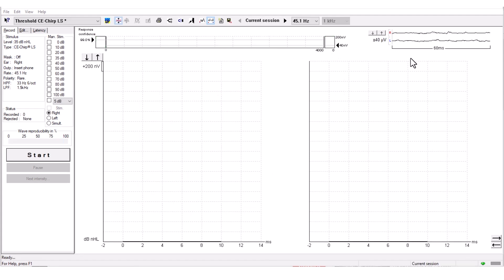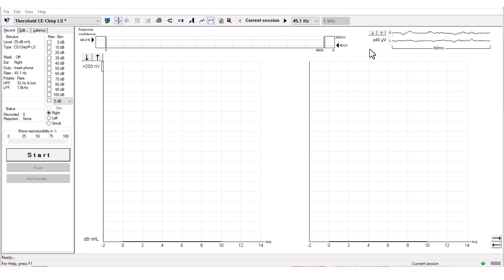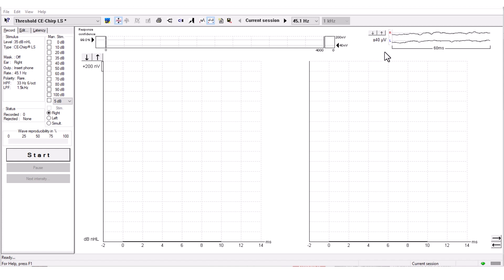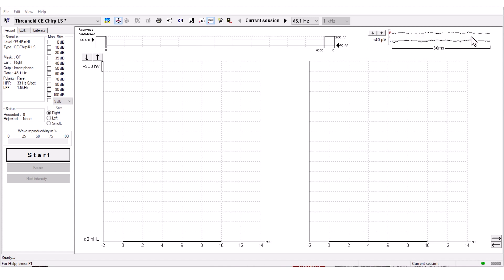The EEG and Rejection Level are here in the upper right-hand corner of the test screen. You can only adjust the rejection level when there is no active recording. The EEG, as seen on the right, shows the electrical noise of your surroundings, which will influence your measurement.